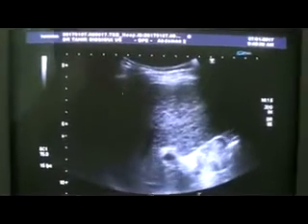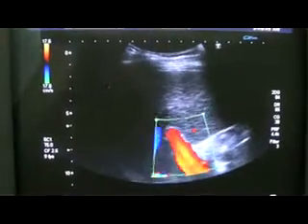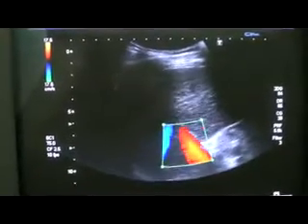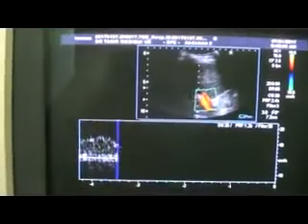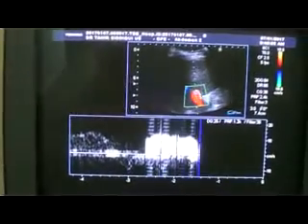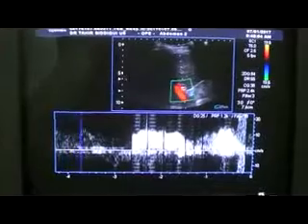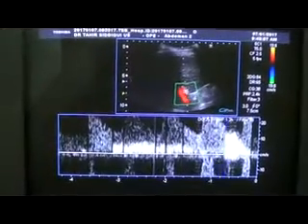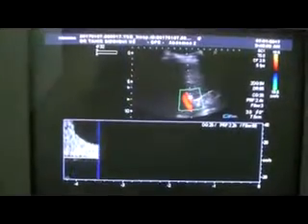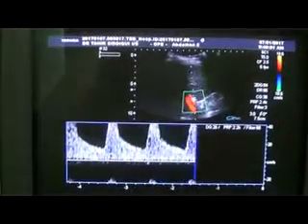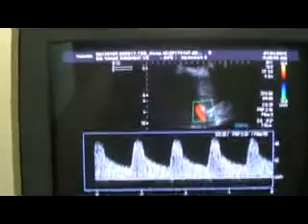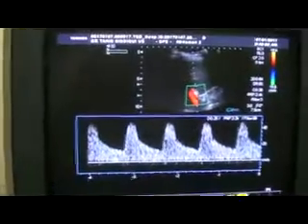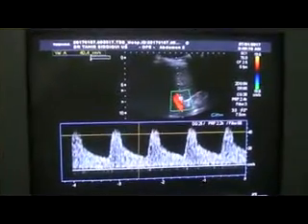This is the portal vein, and the portal vein is patent. This is the hepatic artery, and the hepatic artery waveform is in front of you.